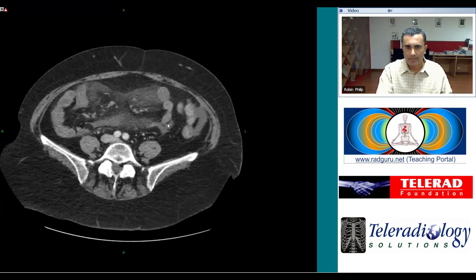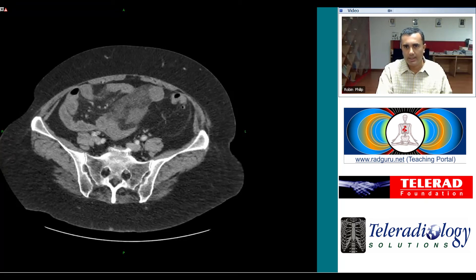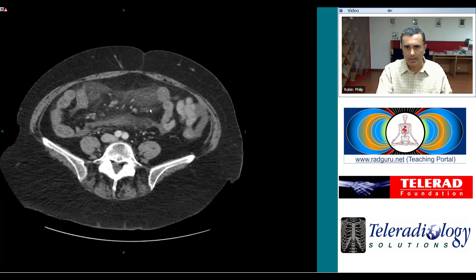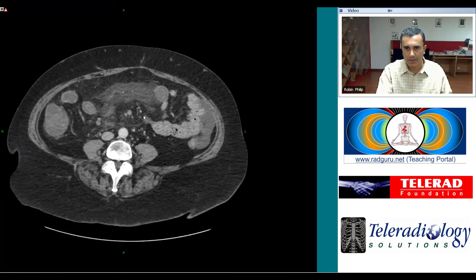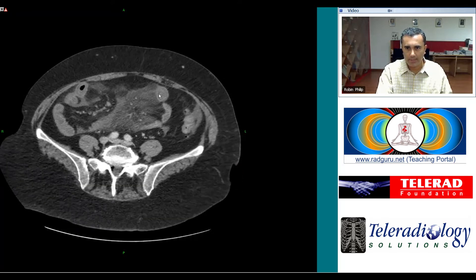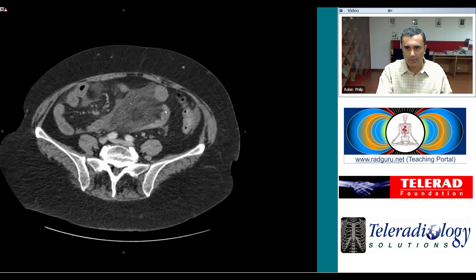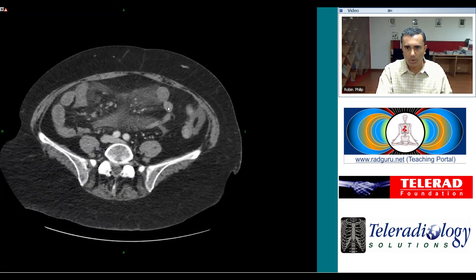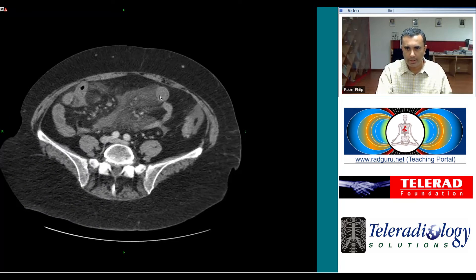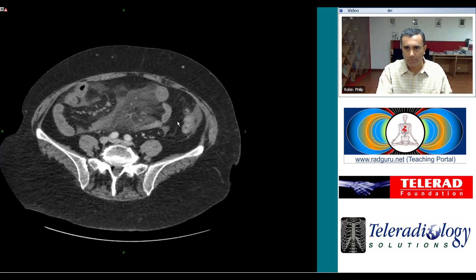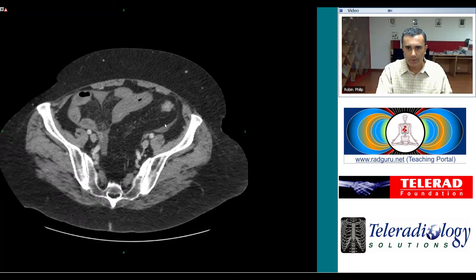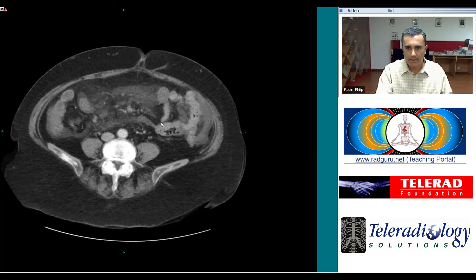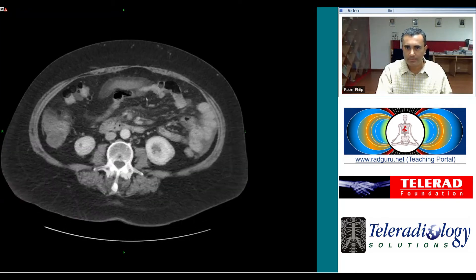As we get further down the abdomen, we start to see some fairly impressive edema in the mesentery — that's all this haziness over here — and some thickening of the small bowel wall to the point that it has a target or bullseye appearance in cross-section.